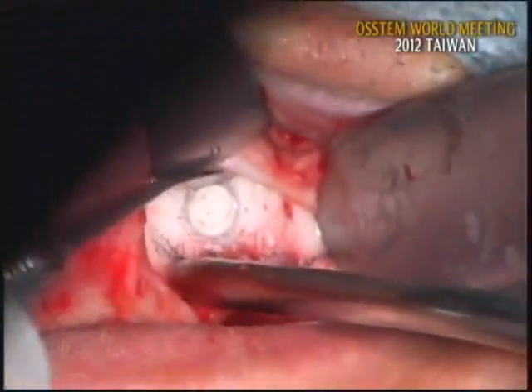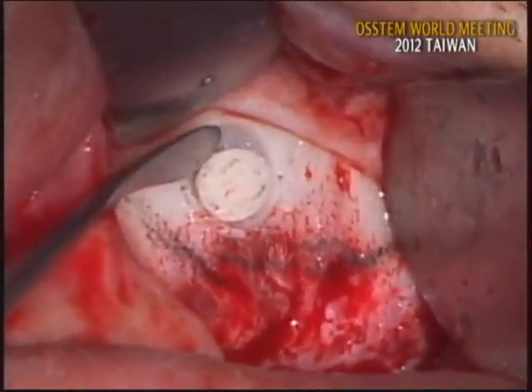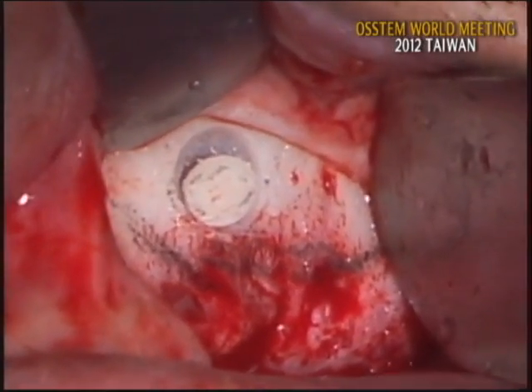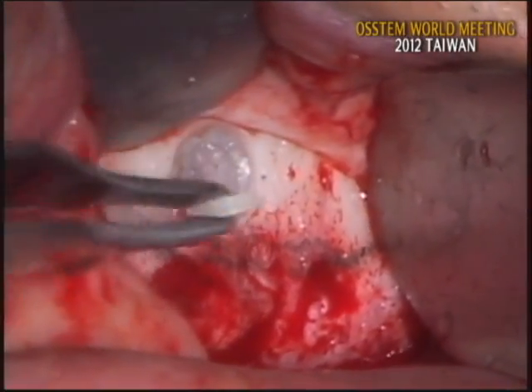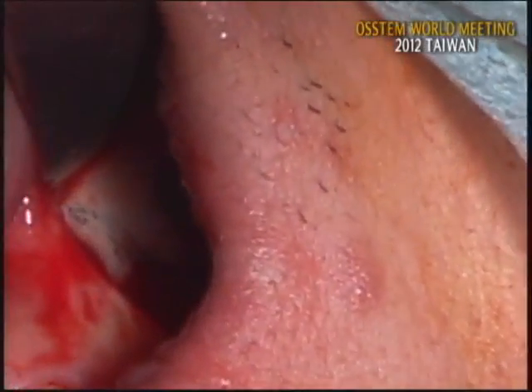Let me see. You can see the grayish discoloration around the osteotomy site. So I'll try to fracture it out. As you see, it's very easy to open the lateral wall. Okay, it was successfully detached. Let me separate the membrane.